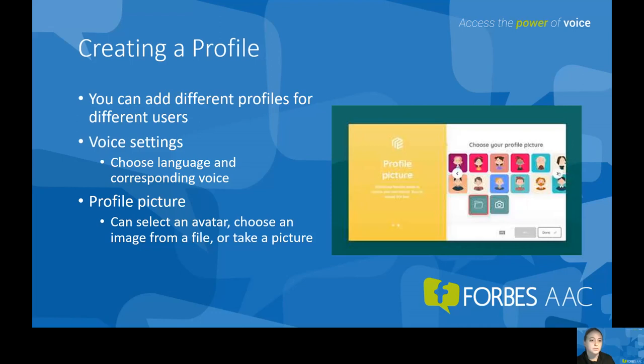It's super easy. You go to the menu and click 'change profile,' then click 'add profile.' Within that, you can name each user and personalize it by choosing a language and a voice for the user. For the profile picture, you can choose an image from a file or take a picture with the camera on the device. You can also select an avatar — there are several pre-programmed on the software. When creating a profile for the first time, make sure to select the MindExpress starting pages from the portal that are appropriate for the user.